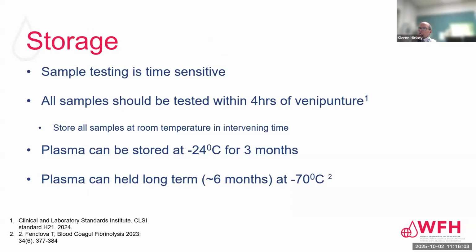Now, when it comes to storage, these are enzymatic reactions. Sample testing is time sensitive. The general recommendation from CLSI is that all samples should be tested within 4 hours of venipuncture. This is for samples stored at room temperature. It's clear if you're in a country where you have higher temperatures, a higher room temperature can affect the stability window. So if you are going to test samples outside this 4-hour window of stability, you would need local data to support that approach.